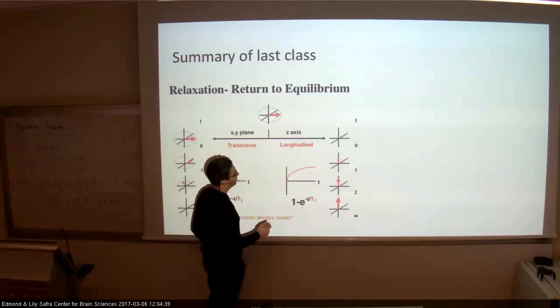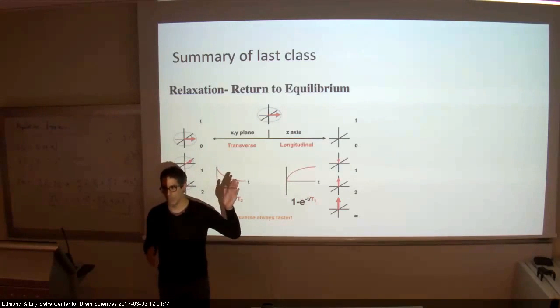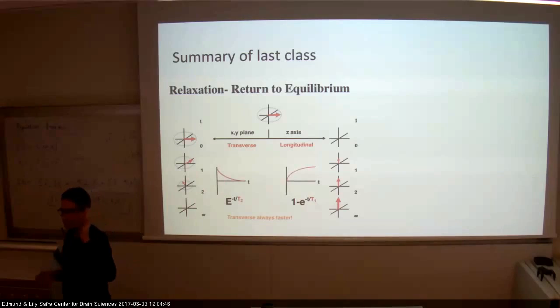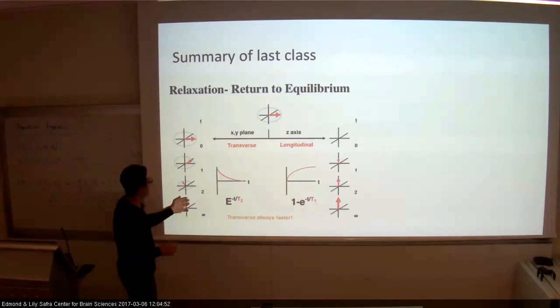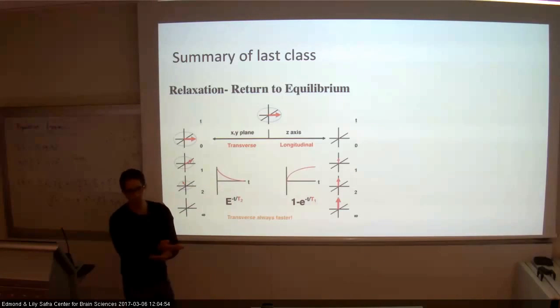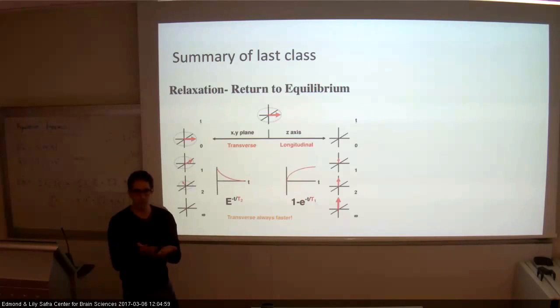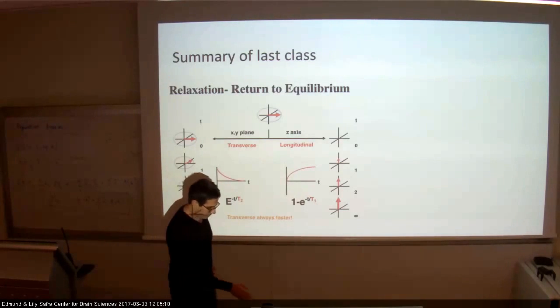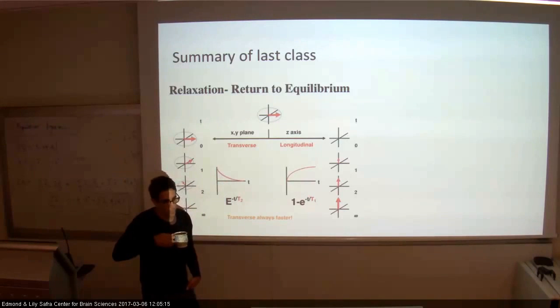The longitudinal relaxation, which is essentially the vector coming back to project toward the z direction, the main magnetic field, and another relaxation, which we said is faster. That was the T2, and that was the dephasing. The signal was lost because those protons, those spins, were losing coherence, getting out of phase, and so we lost the signal before it was fully relaxed in terms of the z direction. Is that what we actually measure, the transverse magnetization? The projection toward the transverse plane.